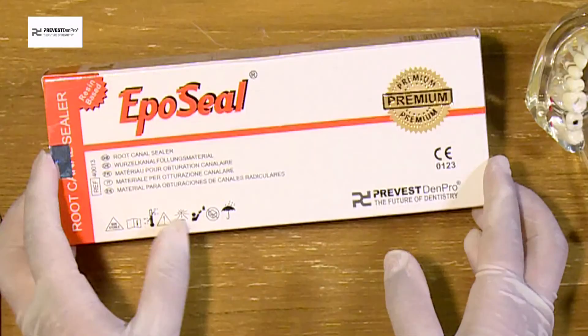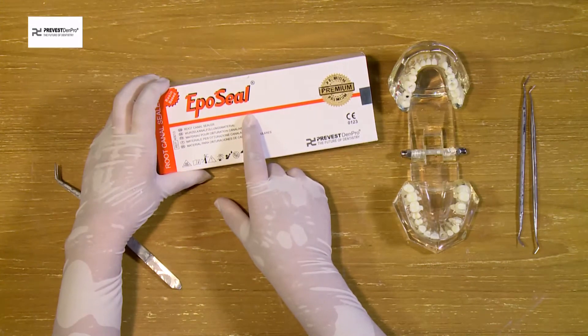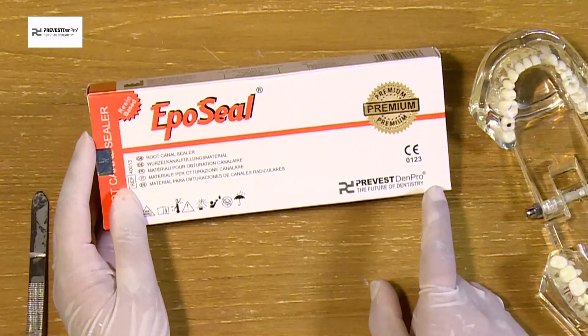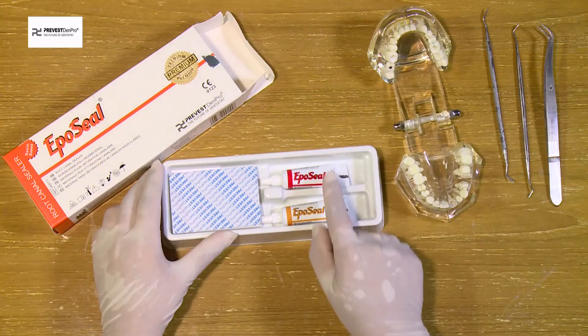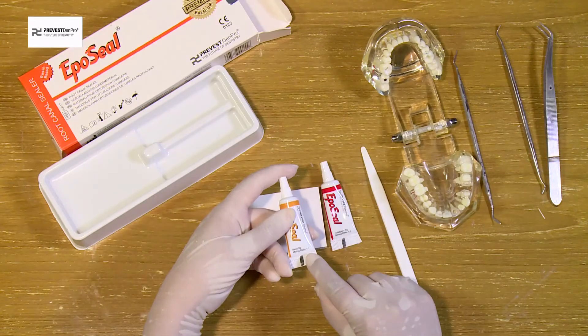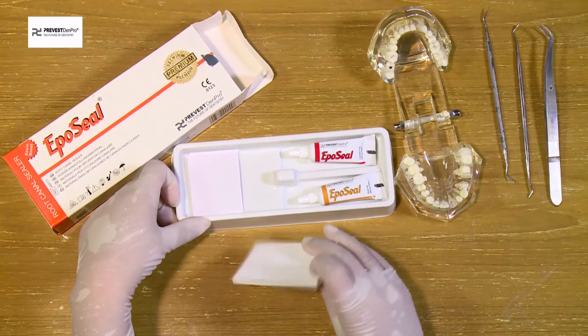We hereby introduce the new epoxy resin sealer EpoSeal, manufactured by Prevest Denpro Limited. The kit contains two tubes: a 9 gram base and a 4.5 gram tube containing the catalyst. The kit additionally has a mixing pad and a detailed instructional manual.